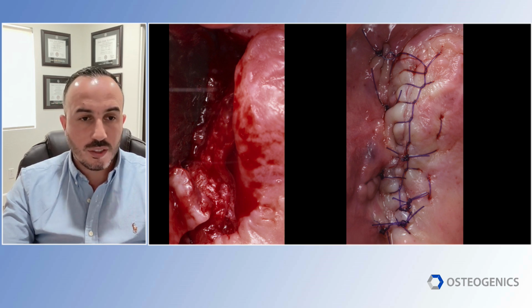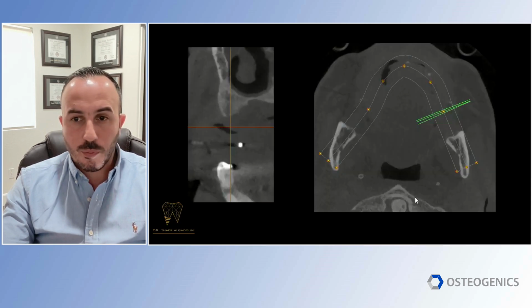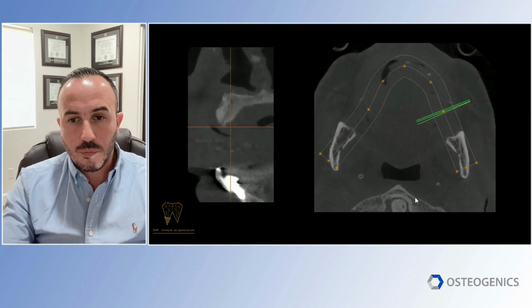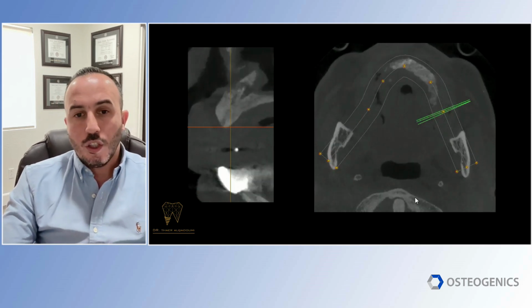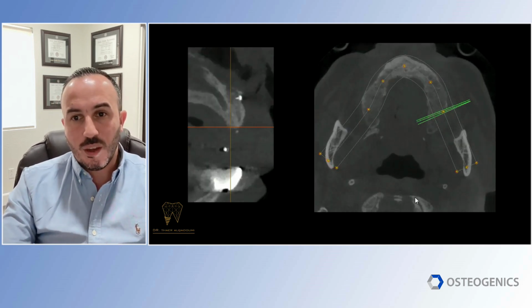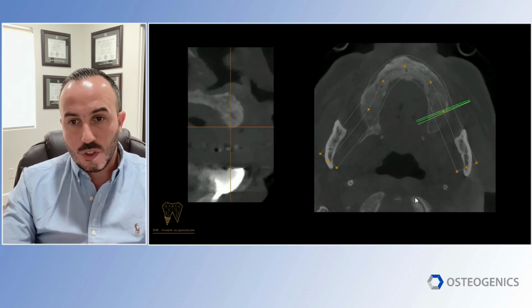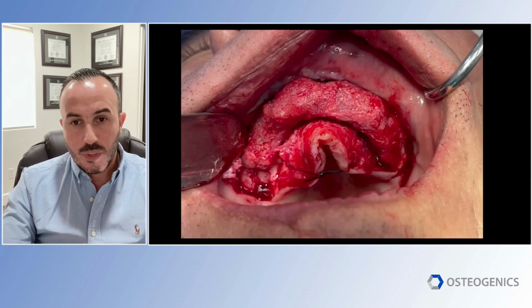If there's any pseudoperiosteum, anything that would later on ossify and become bone, I want it to happen. So we let it heal, and we bring the patient back 9 months from the day that we did the initial augmentation, 6 months from the day that the exposure happened. So we can see on the CBCT that we have regenerated good bone on the vertical and on the horizontal aspect, considering where we started.